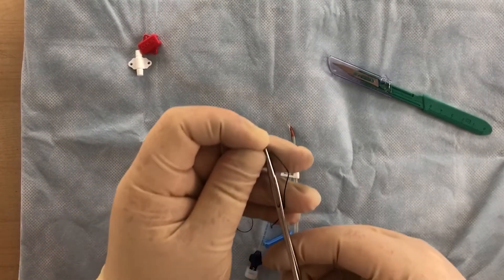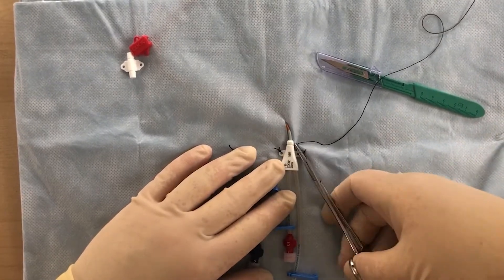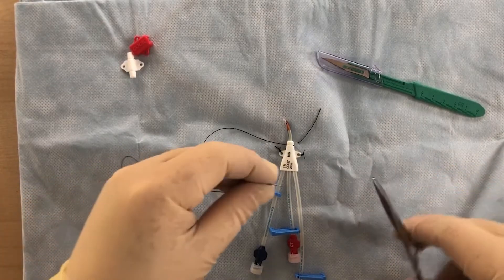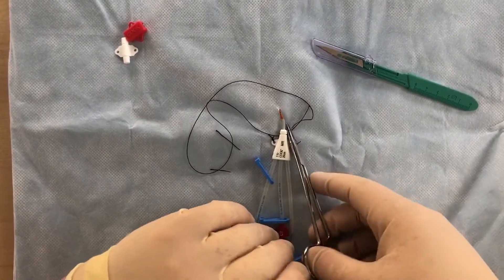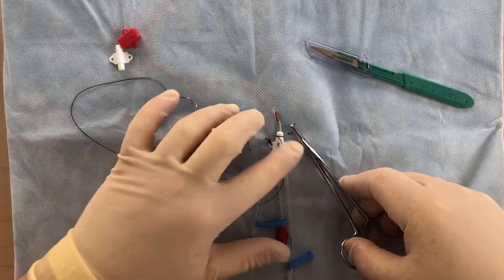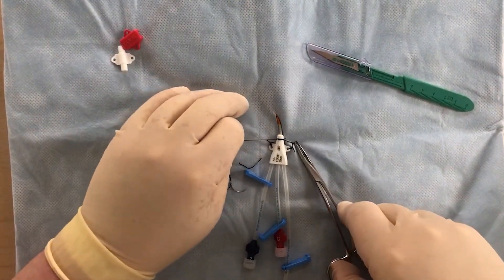This one's a little bit trickier, so I'm going to make sure I get my bite with my needle driver off to the end here, make a bite there, go underneath the hub, pull myself some slack, and then I'm actually going to wrap this around again. So then I get a nice wrap here and make sure this line goes into the area there. I kind of pulled this a little, so I'll pull a little bit back — just enough there. Now I'll tie this on the same side by going back over it, because that will make a nice secure tie, and the skin will come up.